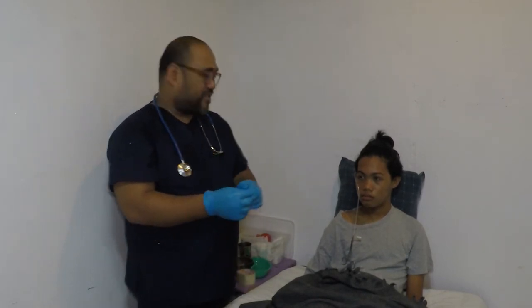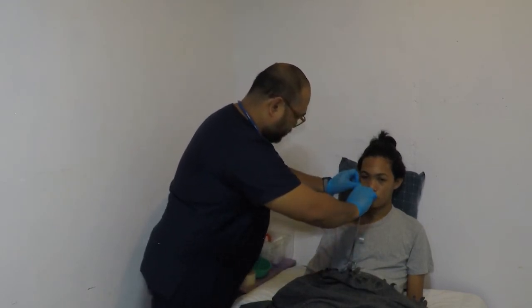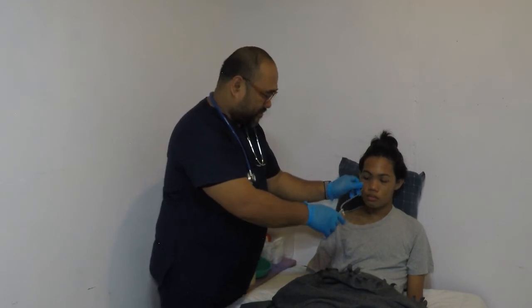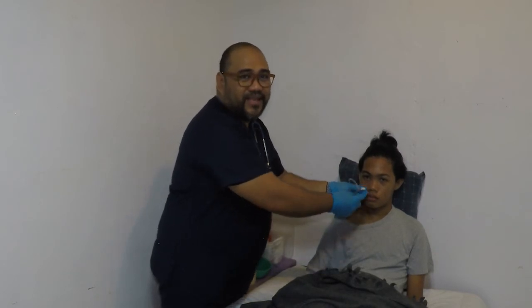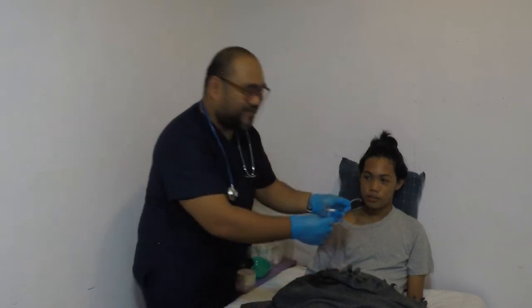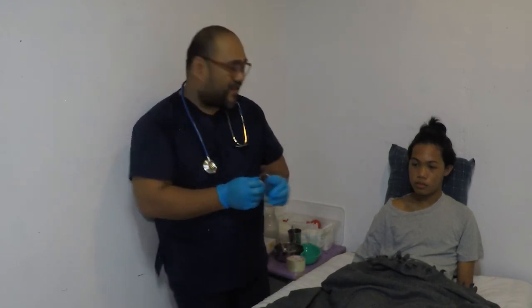Okay, then we will remove the tube. Take out the adhesive tape which is holding the nasal gastric tube to the client's nose. Remove the tube by deflating any balloons. Simply pull it out slowly at first and then rapidly when the client begins to cough. Then conceal the tube. Be sure to remove any tapes from the client's face. Acetone may be necessary.